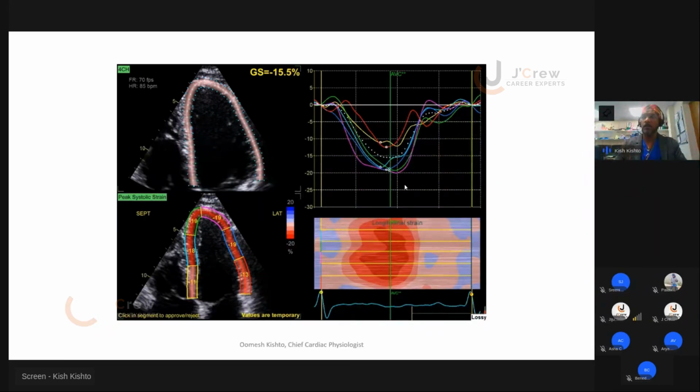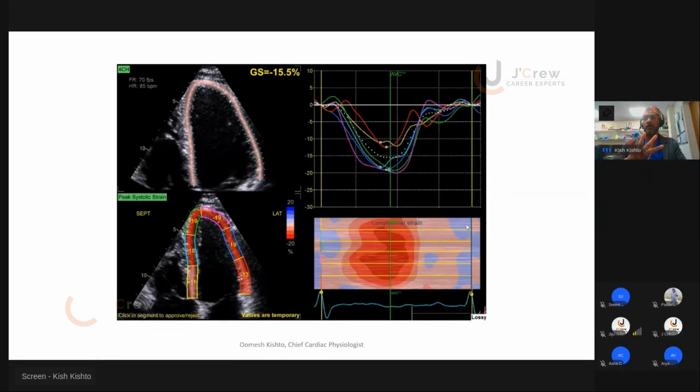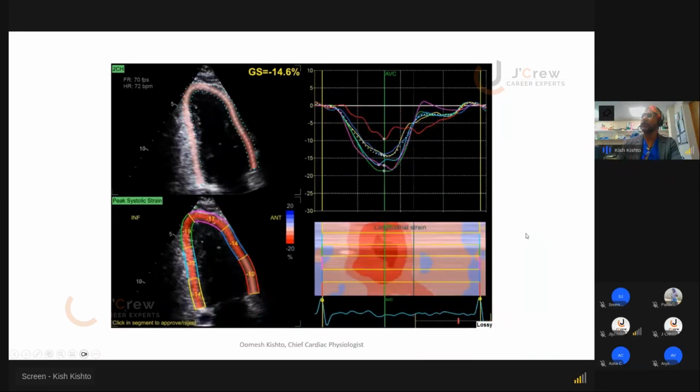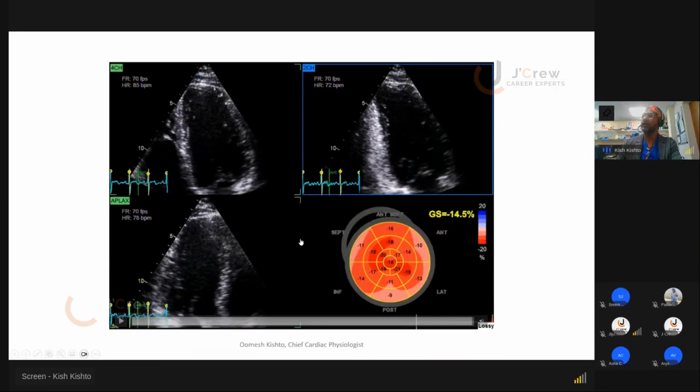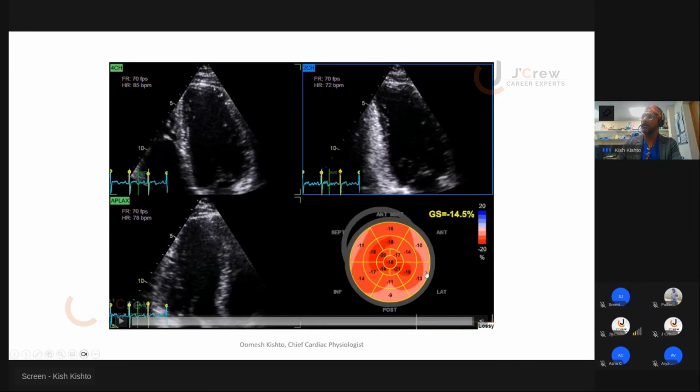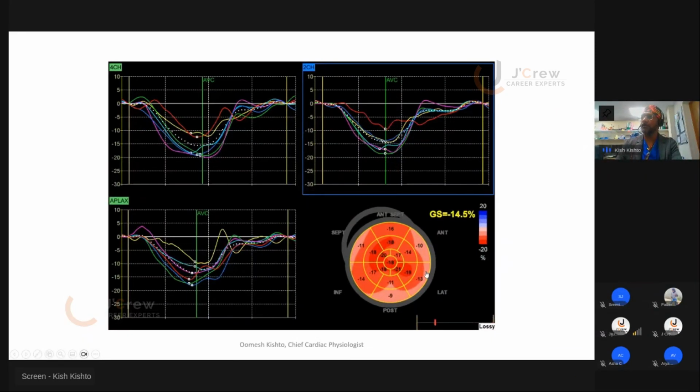I don't know what other machines have, what option, but once you click on, let's say, the apical four-chamber view, and then you click on measure AFI, and then sometimes it will pick the best frame and work it out, and then you need to adjust it if you need to. So we've done that, and this shows you all of it together, the chart there.